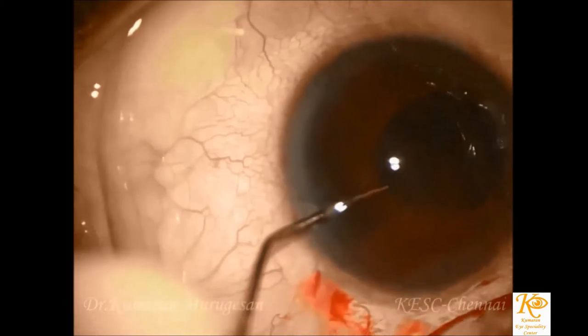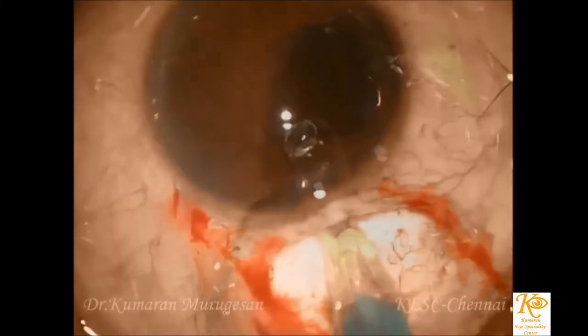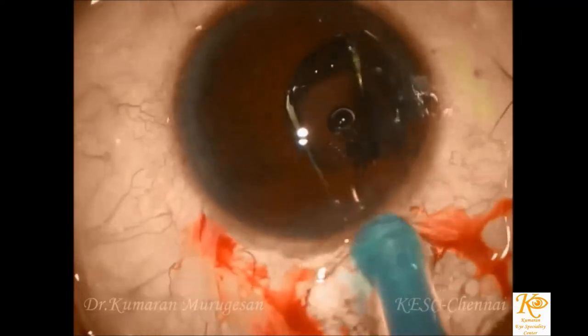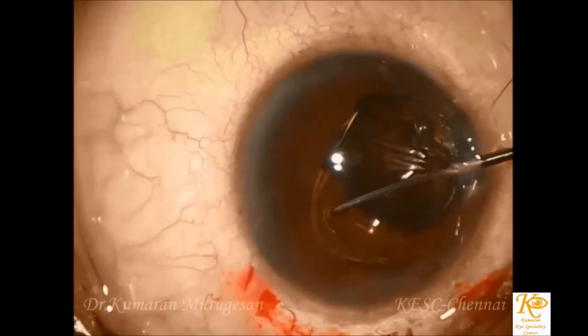Cortical aspiration and irrigating the bag to remove the cortical remnants is done with extreme care. The intraocular lens is then placed in the bag under a cohesive viscoelastic device, with the haptics of the IOL directed in the coloboma area.